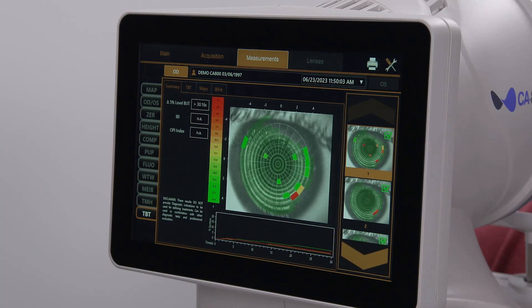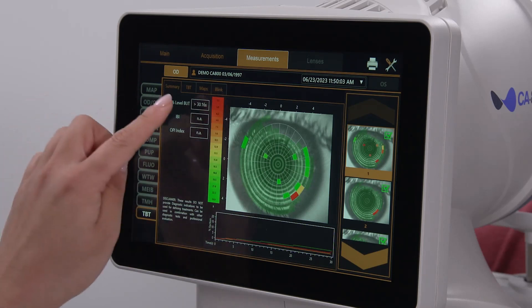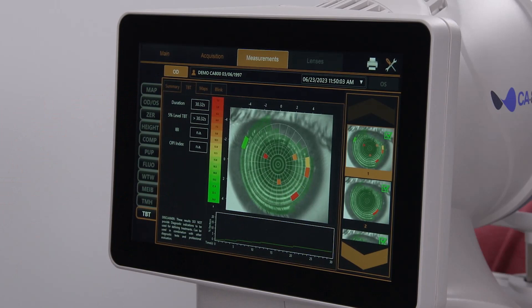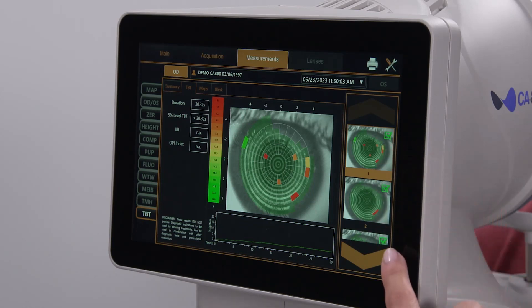If multiple tear breakup time tests were performed during a single visit, each TBT acquisition will be shown in a different color. The TBT tab is essentially the same as the Summary tab, except the data applies to a single acquisition. Again, you can select the acquisition to review on the right-hand side.